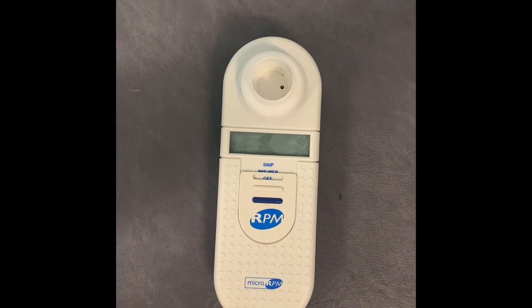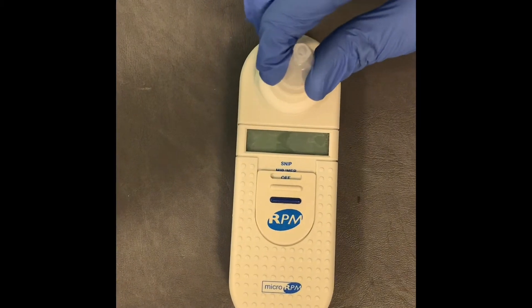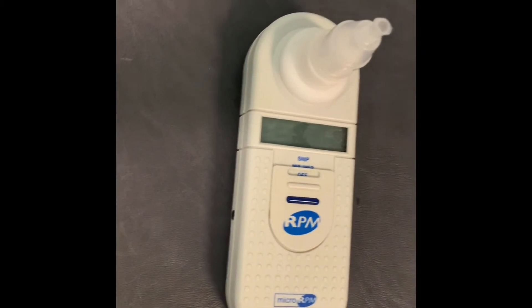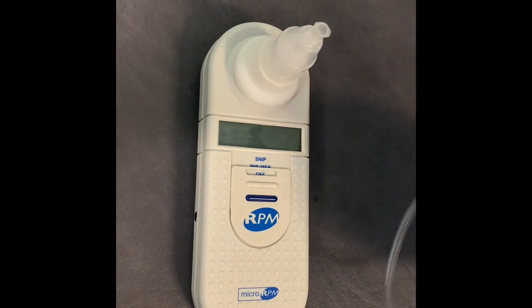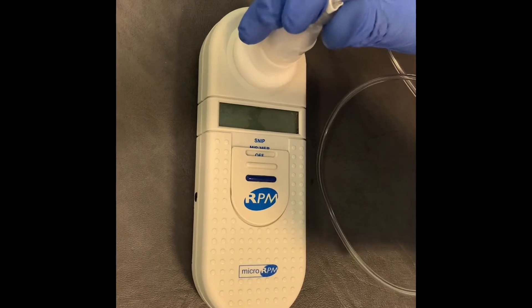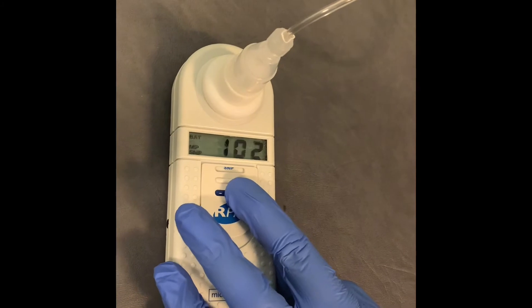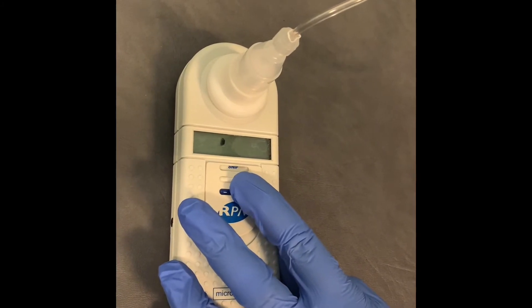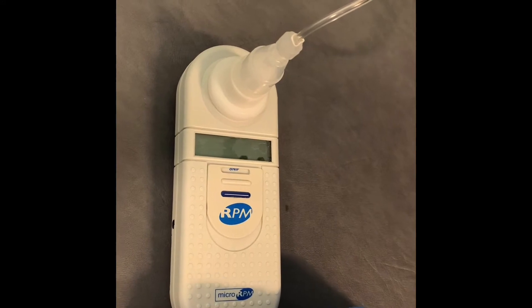When using the micromedical device, you connect the filter into the top port here, and then to attach that, you connect the snip probe by just twisting it on gently. To turn it on for a snip, push this dial up to the very top. When the device beeps, it's ready to take a measurement.